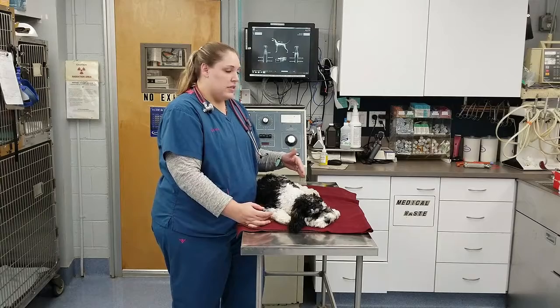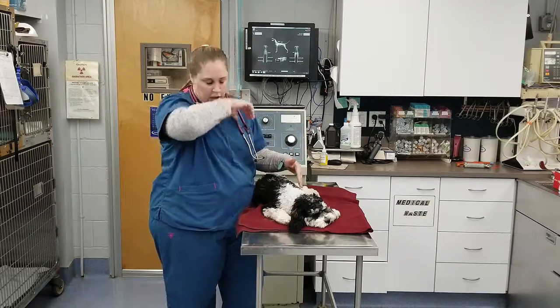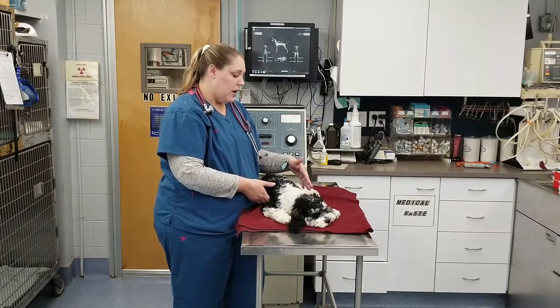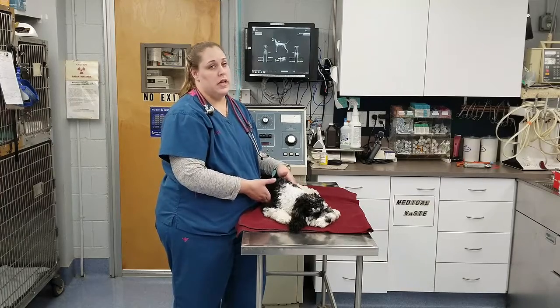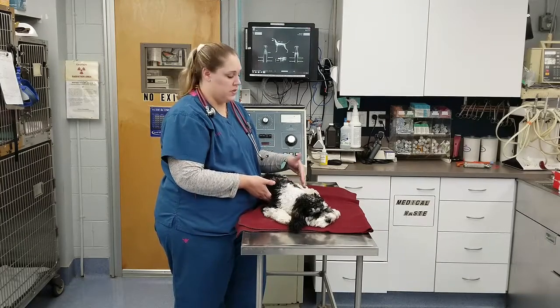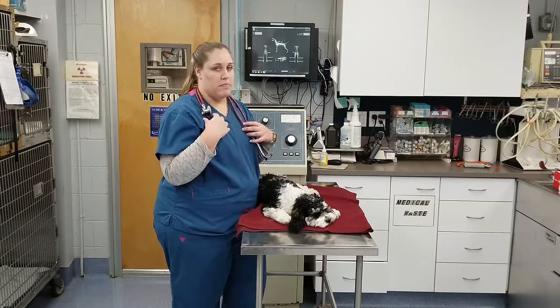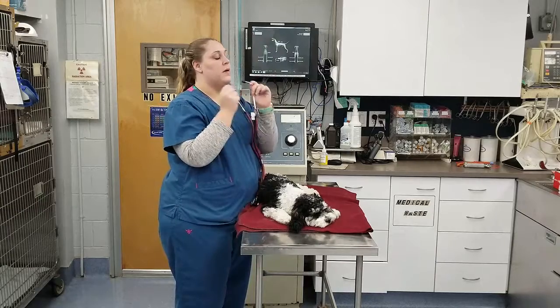The other thing to note is that when we're listening, we want to listen to both sides of our patient's chest, both to hear if there's a murmur in the heart, but also to listen to both sides of the lung lobes to make sure that there are not crackles on one side of the chest and not the other. Okay, so we're going to listen to both sides of the lungs as well as both sides of the heart right now.